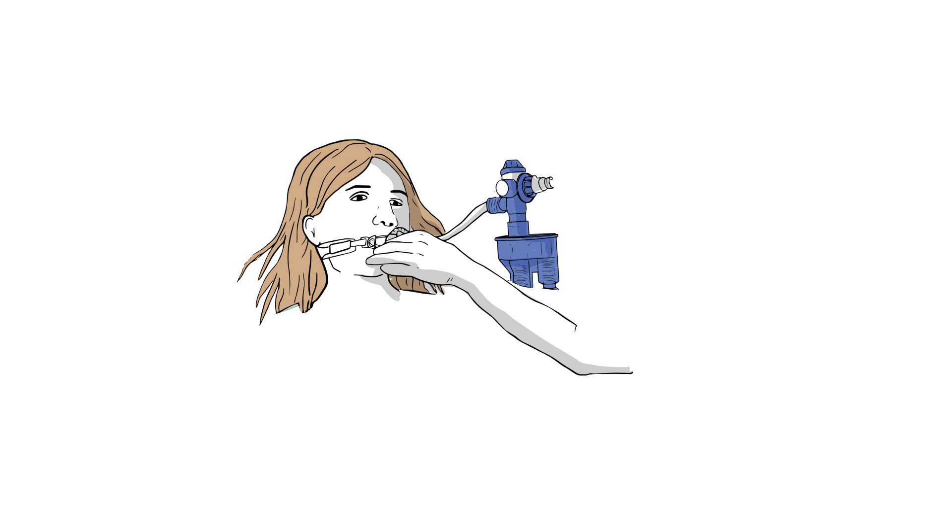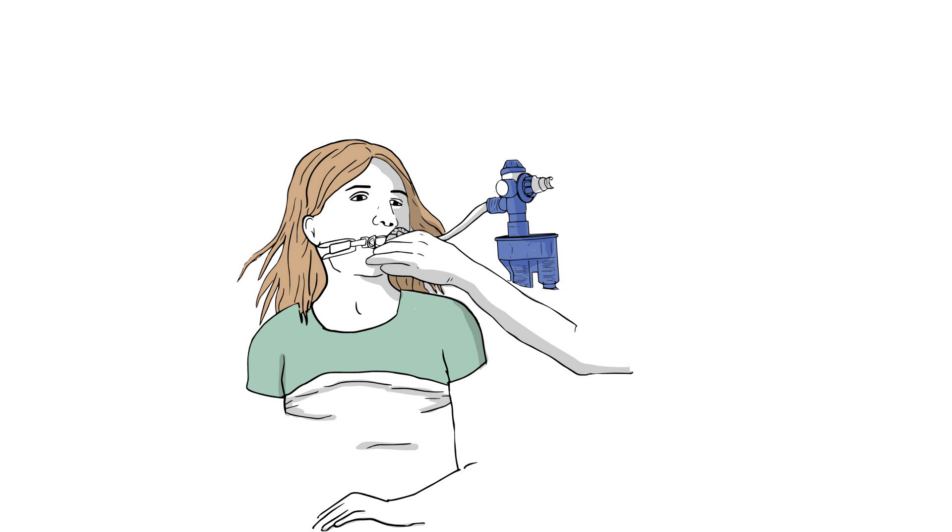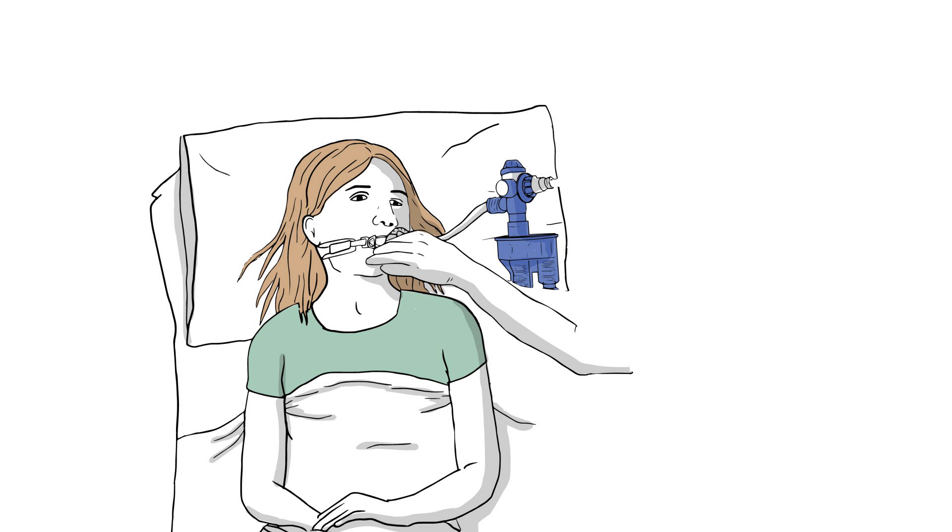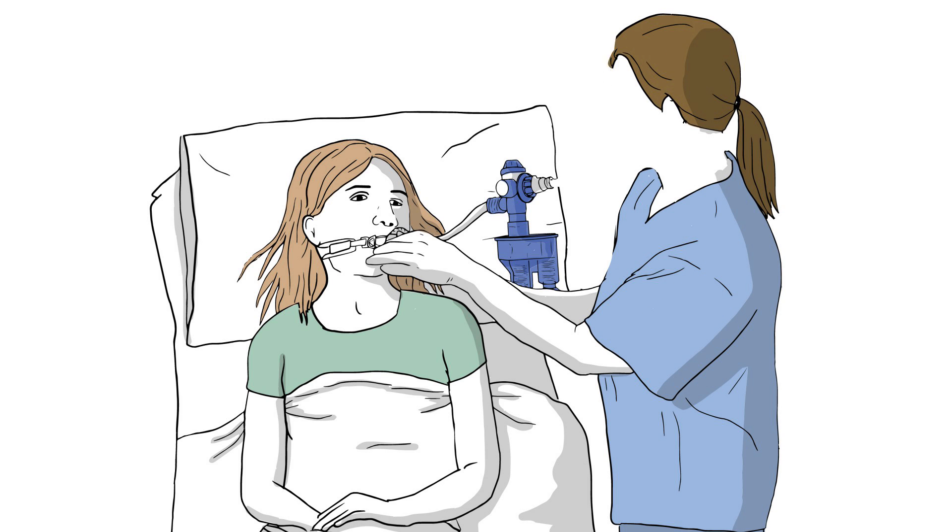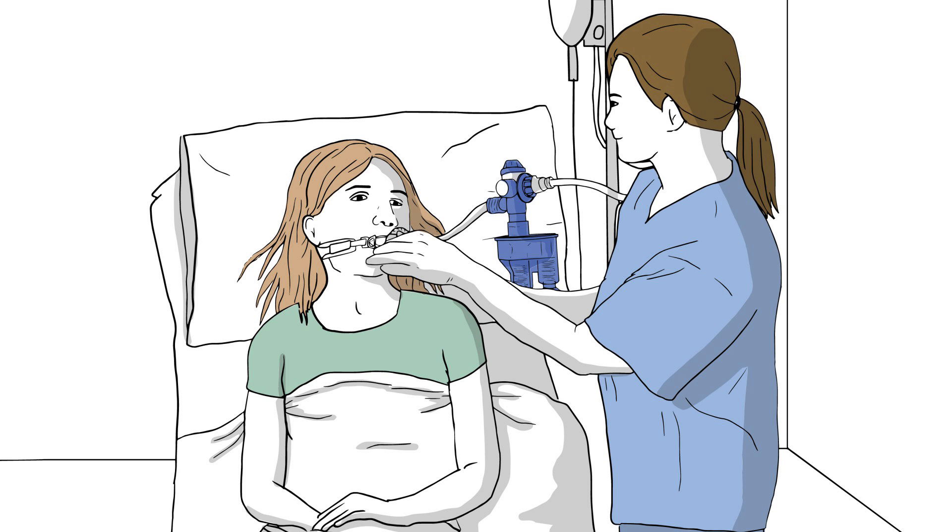Vortran Medical uses pulmonary modulation technology in the majority of our products, which sense the changes in pressures of the patients to adjust to their needs. We use this technology because of the benefits it can offer.